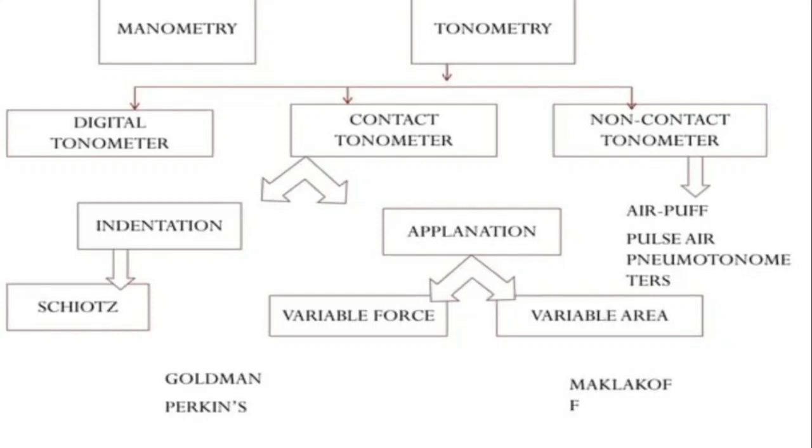There are types of tonometers. Basically, there are two types: manometry and tonometry. Tonometry and manometry are techniques used to measure intraocular pressure.